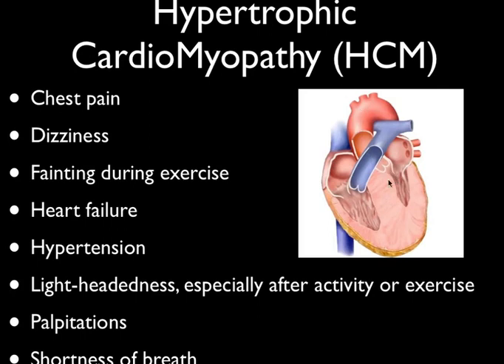And so to identify this, you can't really diagnose it using an EKG. It doesn't have good enough test characteristics, but ultrasound has excellent test characteristics to pick this up. It's really easy to do. Now that you know how to get a parasternal long axis, this is actually a relatively straightforward and easy thing to screen for. I'm just throwing this in there as sort of a clinical correlate to make this interesting.